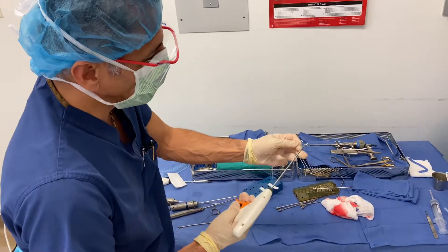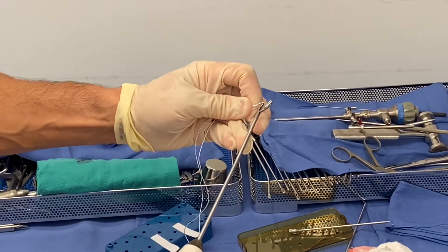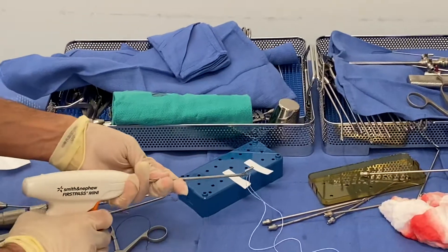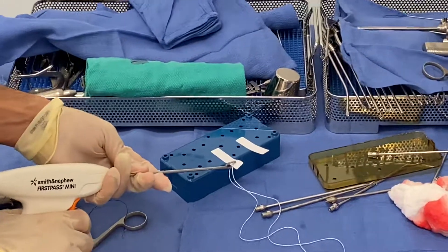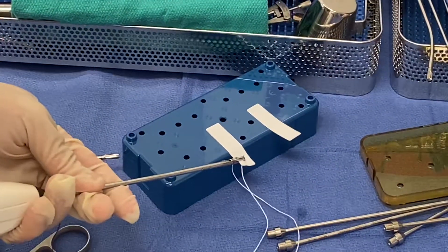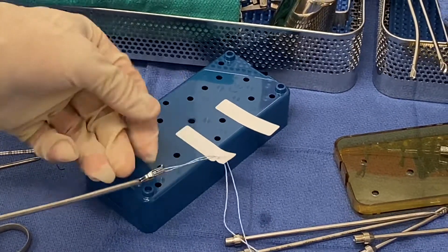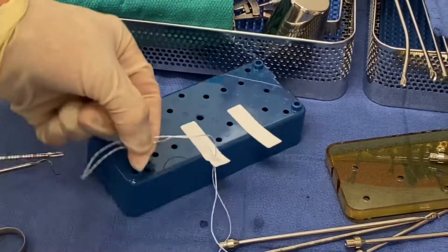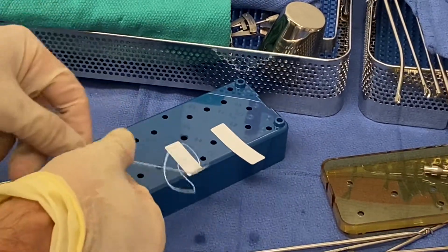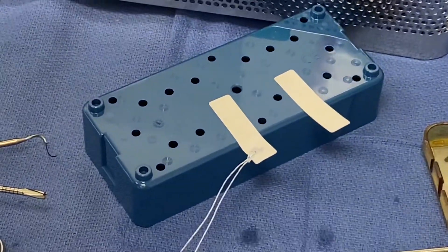This is what happens with this first pass. I double up my number two suture. Number two suture allows me to pull really hard. It's basically like a cut, like a sewing needle. So you go like this, and then you pass it like this. And there you go, you get a loop in there. And then after I get the loop in there, I pull it out. And then I do my luggage tag. That's how I do my root repair.